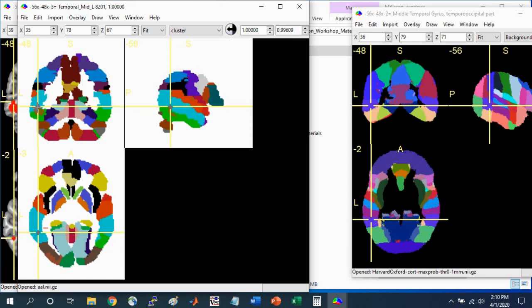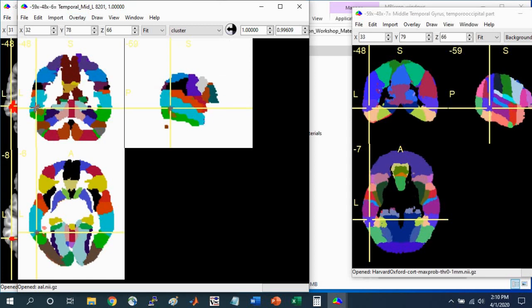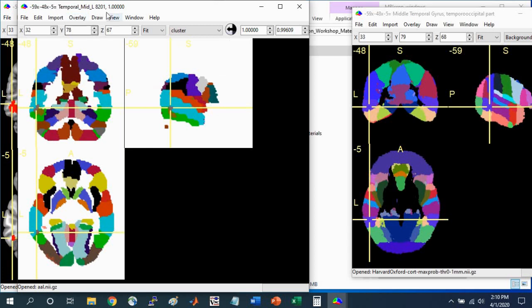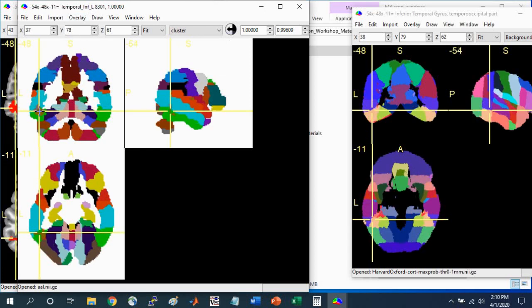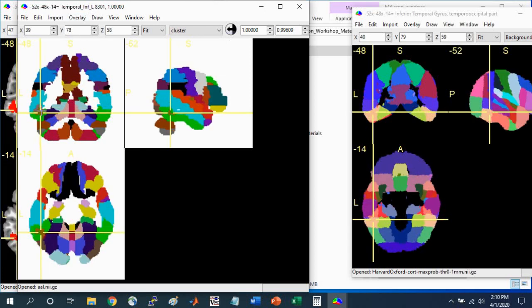You can see that this portion of the cluster is in the left middle temporal gyrus. And this portion of the cluster is in the left inferior temporal gyrus.